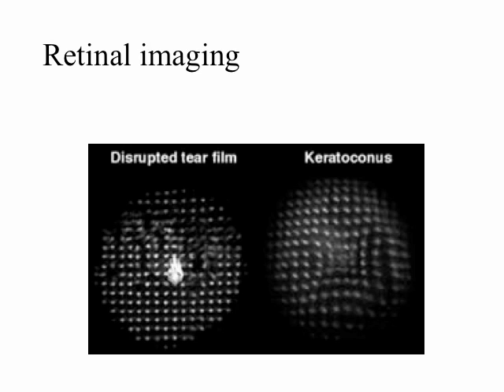And the slide is labeled as keratoconus, and it could be. I mean, certainly one would expect keratoconus to produce a pattern like this. But unlike topography, which we've dealt with up until this point, when we are looking at wavefront, we get the total distortion produced by the total optics of the eye, but we cannot say for certain which part of the eye has produced the aberration. So we're given that this is keratoconus, fine, I'm sure that it is. But in general, when you look at an aberration, you cannot say which optical element in the eye produced it.